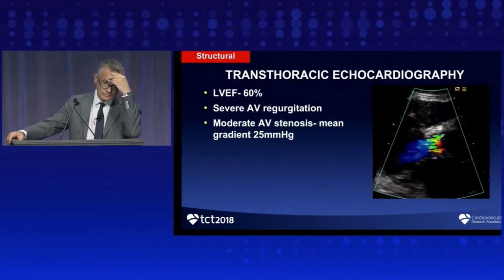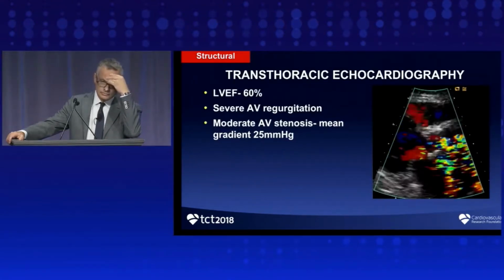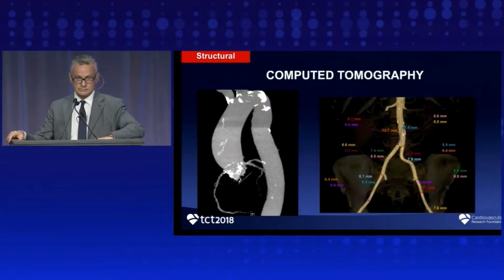Her transthoracic echo demonstrates a preserved ejection fraction, severe aortic valve regurgitation, and moderate aortic valve stenosis with a mean gradient of 25 millimeters of mercury. And her CT demonstrates patent iliofemoral vessels, as well as mild dilatation of the ascending aorta and calcification in the root of the valve replacement.